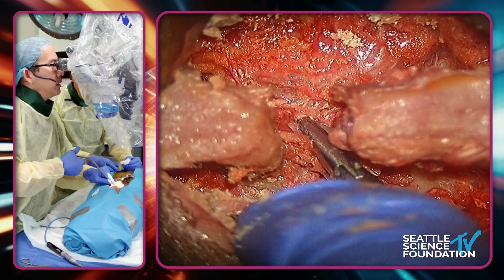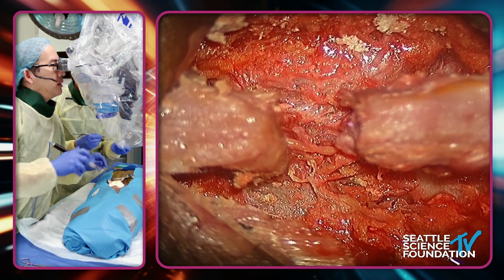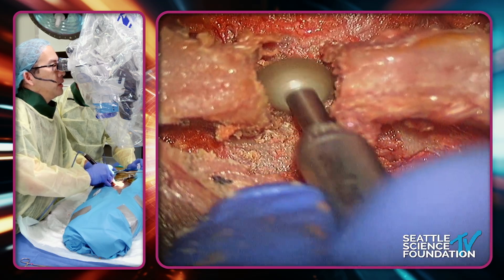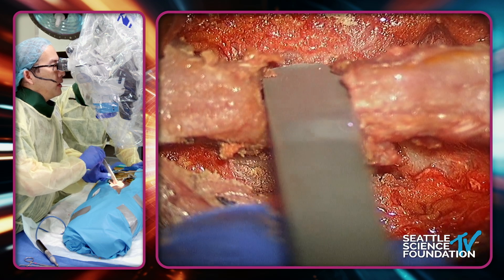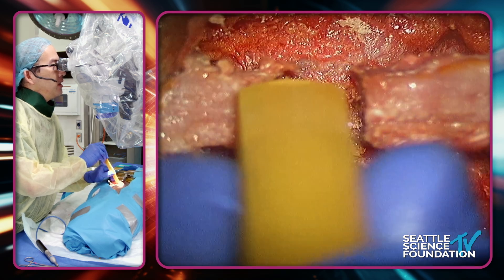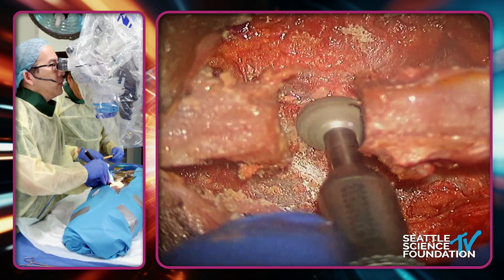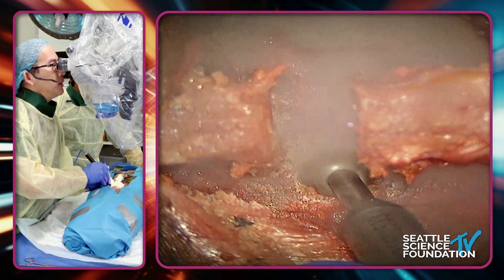This is all the interspinous joint, and then we're getting down to the interlaminar joint here. This can all be done very quickly without really worrying about the thecal sac yet. This is called the rostral landing zone, and you want to make sure you're getting a nice cut. You can ask for the CoFlex trial to get an idea — that's not going to be enough lift with the 8 millimeter, so we're going to go to the 10. This is that carpentry work where you're trying to make a nice fit. This is a really nice lift of about two or three millimeters, so I'm already thinking this is going to be a 10 millimeter CoFlex. Here's the landing zone at the bottom. I see the facet joint — you don't want to compromise that. Preferentially I'm just going to take the laminectomy or laminotomy here.